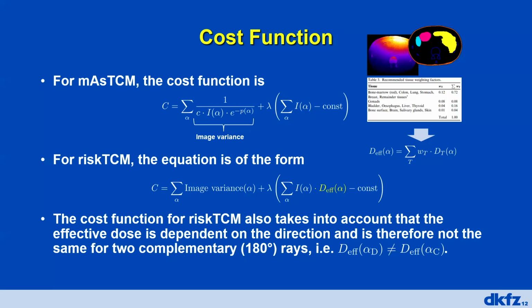And I guess one final question, if nobody raised a hand: how often do you see people in the clinic using photon-counting CT use the small pixel effect? So you said smaller pixels are good for spatial resolution. It's a good question. Most stock protocols don't use this small pixel effect. They usually measure with the larger detector pixels.